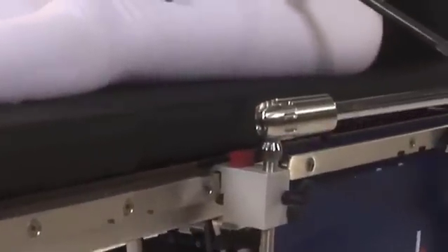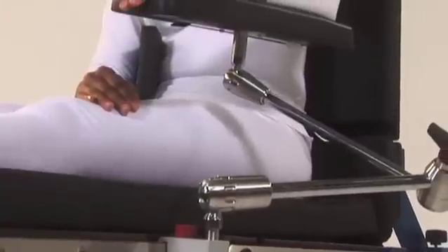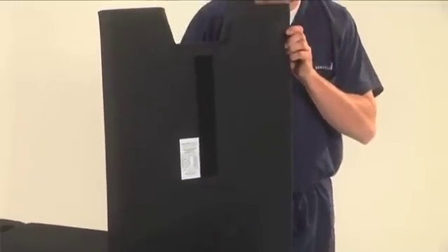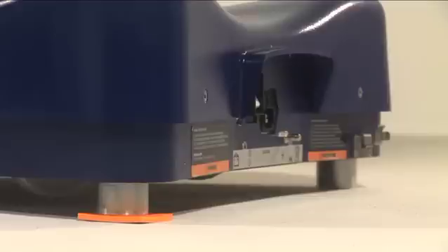The side rails are U.S. standard to ensure your facility's existing accessories will fit the D850. Table pads are attached by a Velcro strip down the center of the pad. To ensure patient and caregiver safety, the D850 is equipped with self-compensating floor locks. If the OR floor surface is uneven, the table will compensate by up to one quarter inch to ensure a stable table surface.